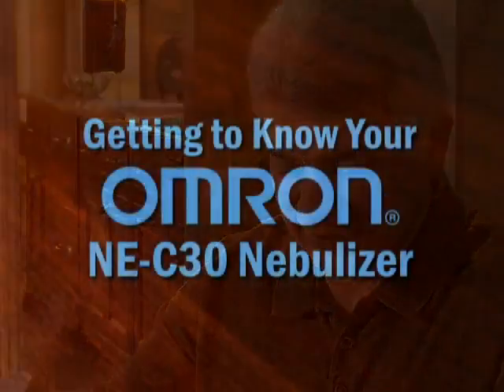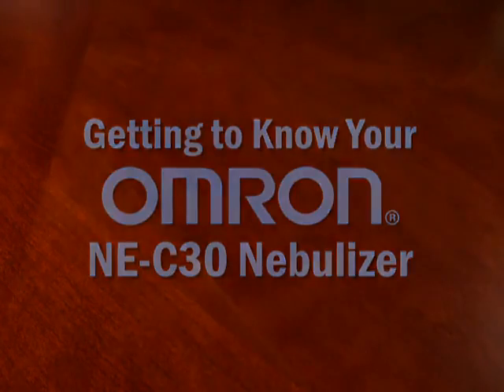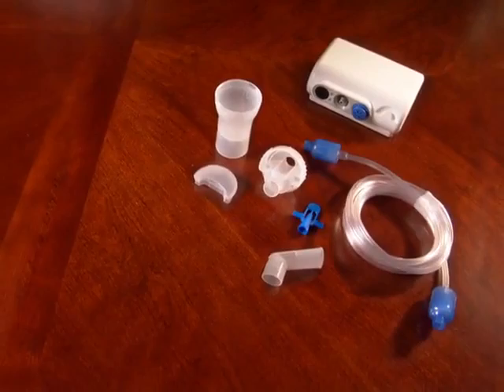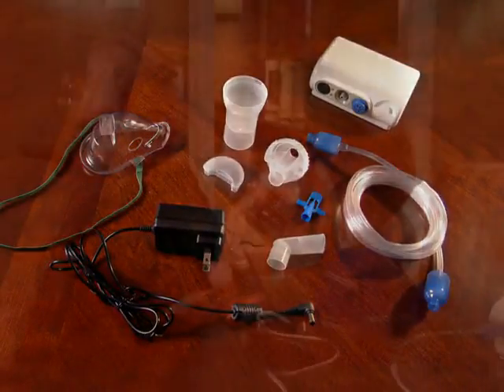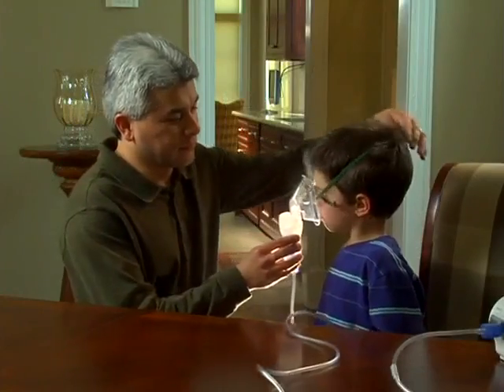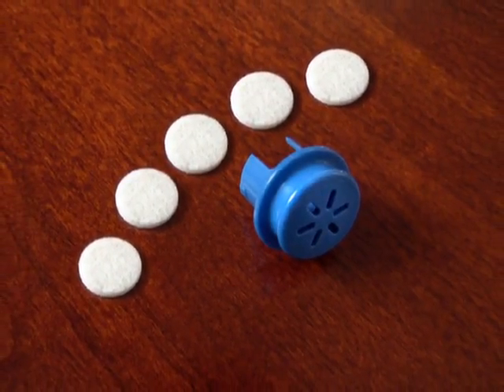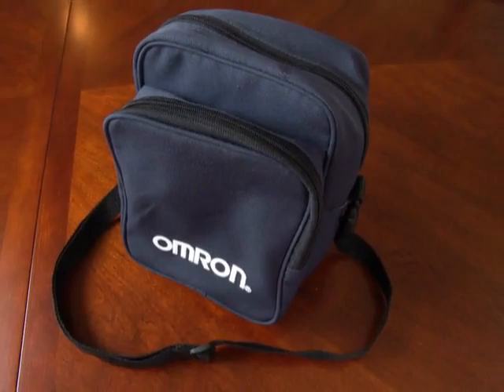Let's get familiar with the Omron NEC30 Compressor Nebulizer. Here's what it comes with: a compressor, the nebulizer kit, an air tube with air plugs, the AC adapter, and a child mask, which can be substituted for the mouthpiece when providing a nebulizer treatment to a child. There is also a package of five replacement air filters and a convenient carrying bag for storage or take-with-you convenience.